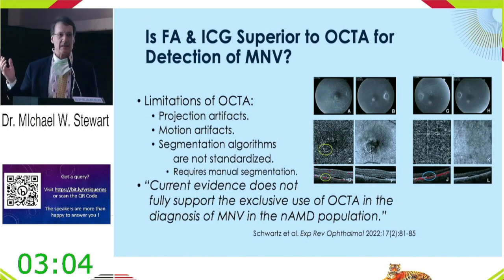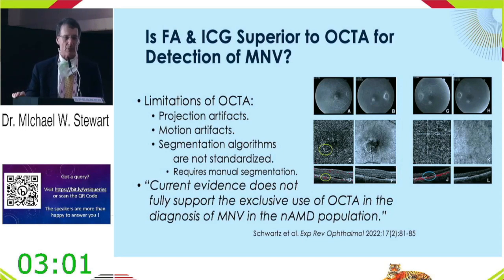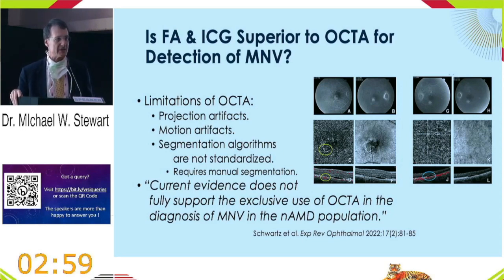And there are limits to OCTA. You can see that projection and motion artifacts and segmentation algorithms limit our ability to see all of the membranes. If we have the ability to go into the imaging room and do the segmentation ourselves, we're probably going to do better. But in a busy practice, that's a difficult thing to do. And I point you to the bottom of this slide, which came out of a review this year, where the authors concluded that current evidence does not fully support the exclusive use of OCTA in the diagnosis of macular neovascularization in the neovascular AMD population.